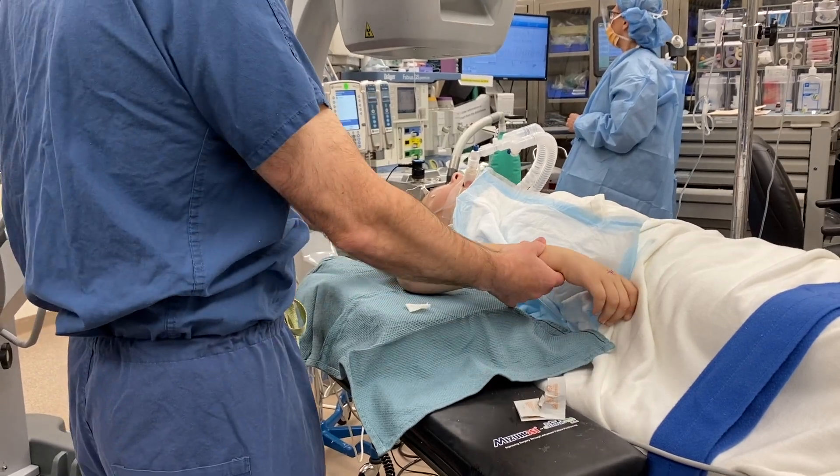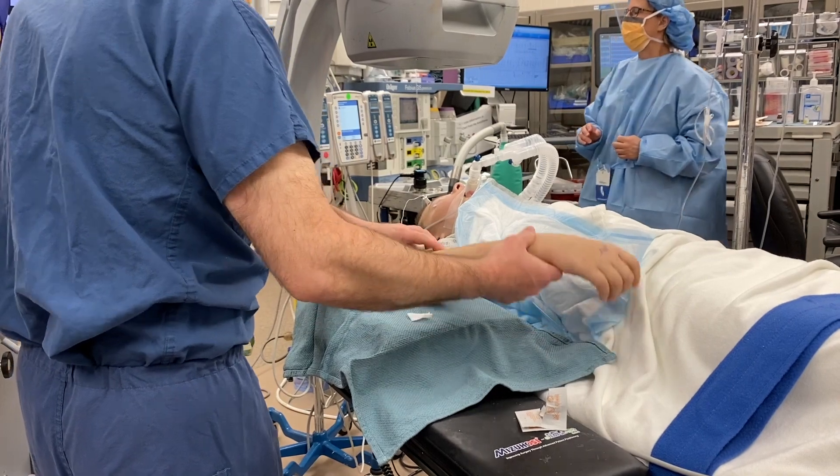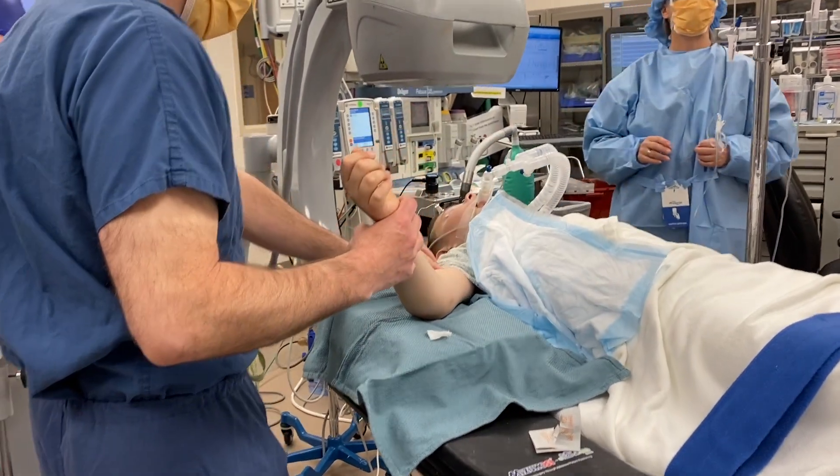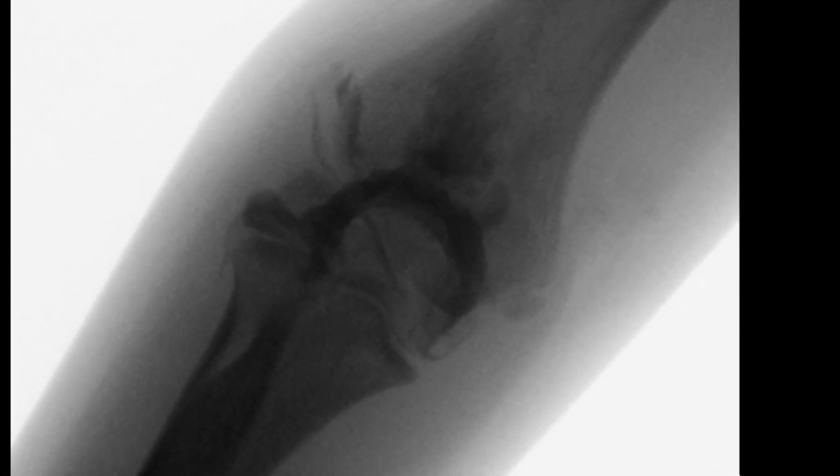The joint is then manipulated to disperse the dye. In this case, the AP view did not demonstrate the fracture line very well; therefore, a slightly oblique view was obtained.